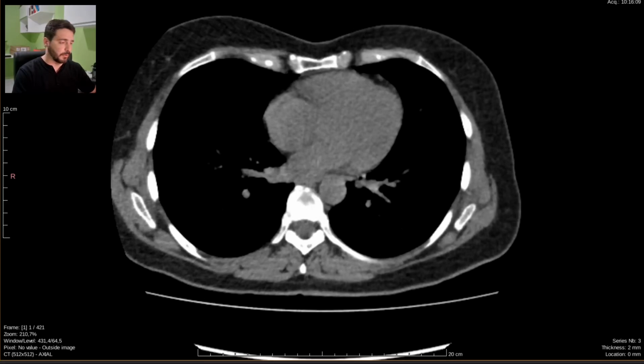The patient also says she could feel feverish, didn't measure the temperature to see if she actually had a fever, and she also feels kind of nauseated, but the left-sided abdominal pain is the main cause of her coming to the ER.